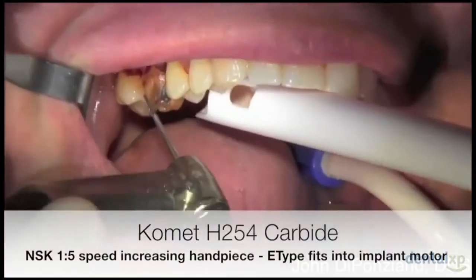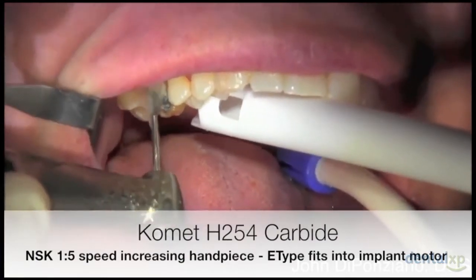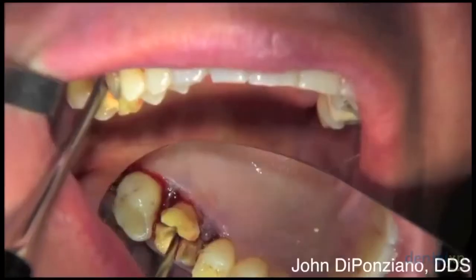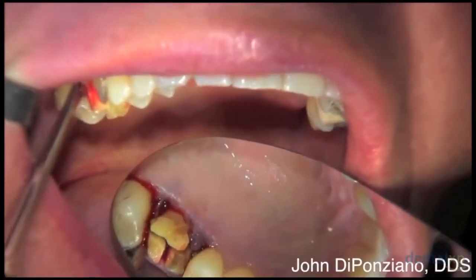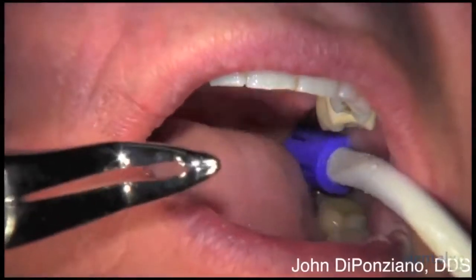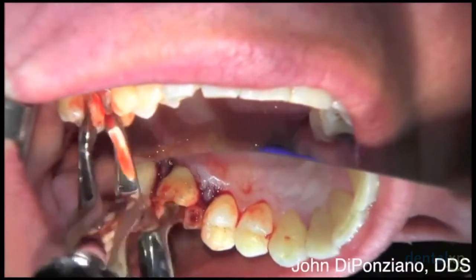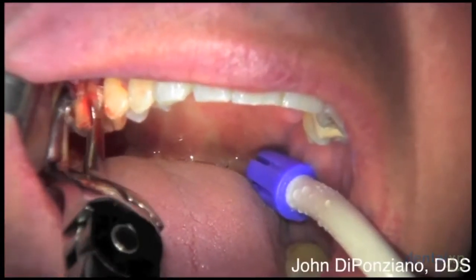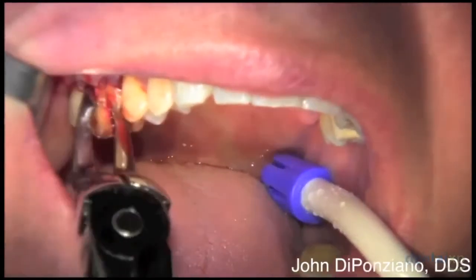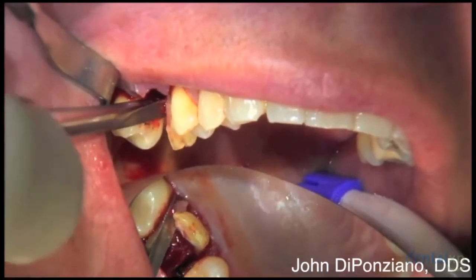This is a Komet H254 carbide in an NSK 1-to-5 speed increasing handpiece. It fits on an implant motor and uses sterile saline — no air comes out of that handpiece, so it's used for extractions. Elevate the roots after they're separated and remove them with a straight beaked forcep, being very careful not to disturb the facial plate.